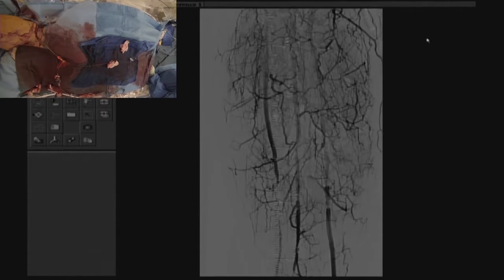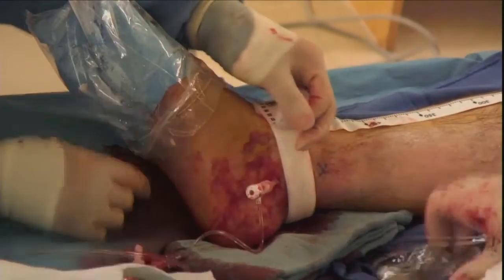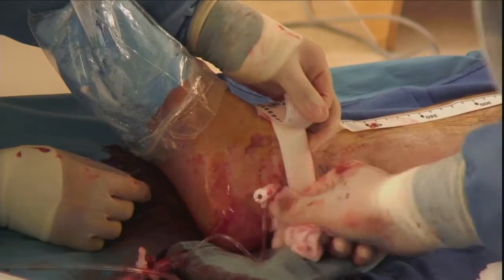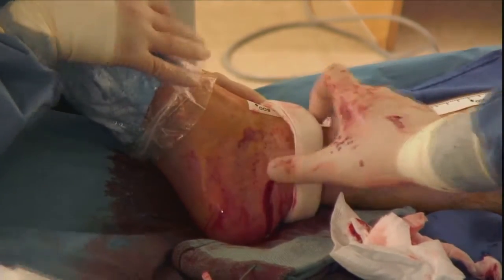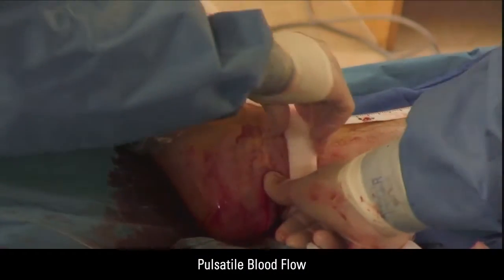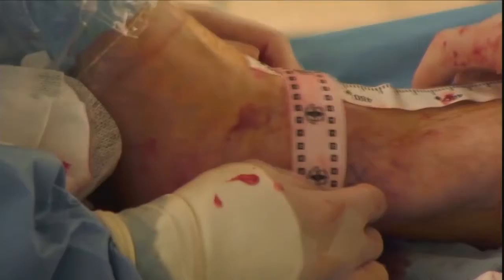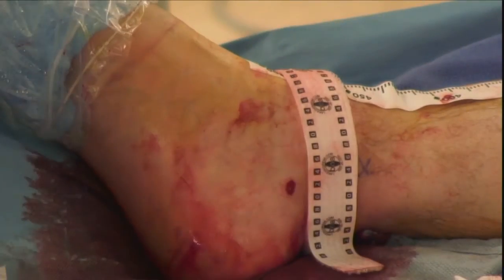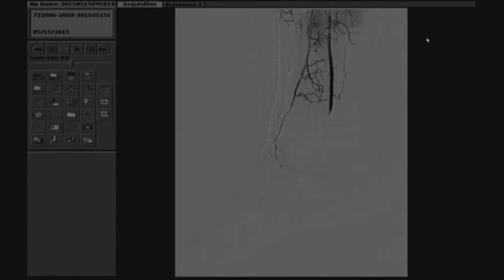Having the tibial-pedal sheath in the posterior tibial artery acts as an embolic protection device, allowing us to bleed the sheath between balloon inflations to avoid any macro debris reaching the plantar circulation. After performing balloon angioplasty, the next step is to evaluate flow to the plantar circulation. You can see the sheath placed in the posterior tibial artery with the tip of our hemostat holding the flossed wire. Once we secured flow through the trifurcation of the popliteal, TPT, and posterior tibial artery, we remove the sheath. You can see the pulsatile blood flow coming out of our access in the posterior tibial artery.